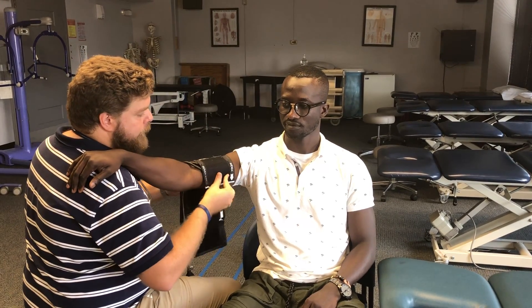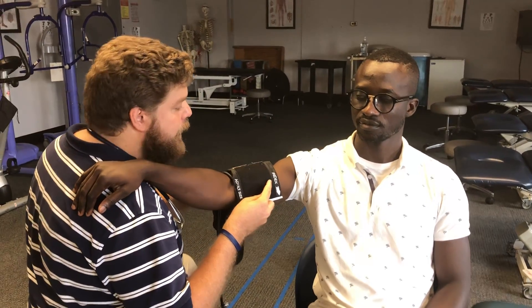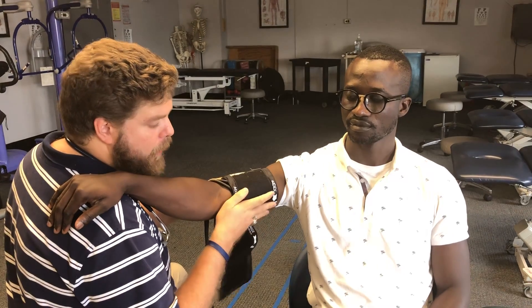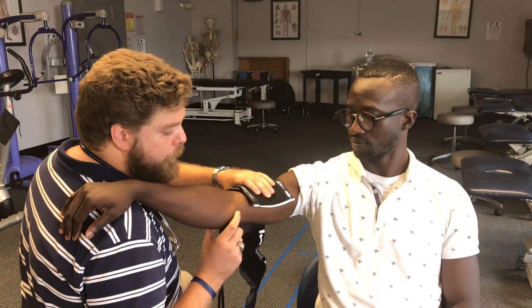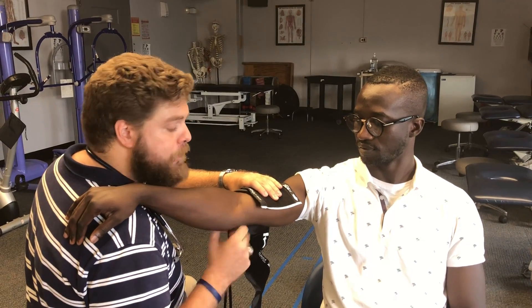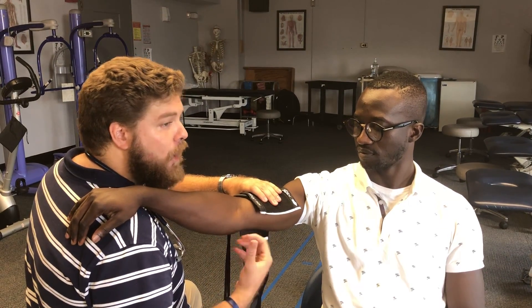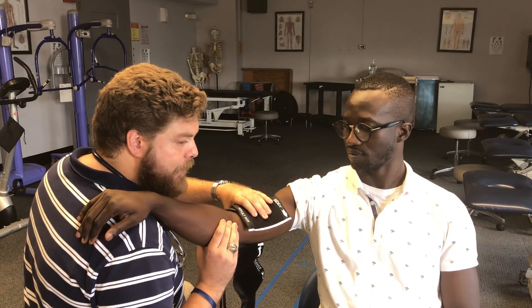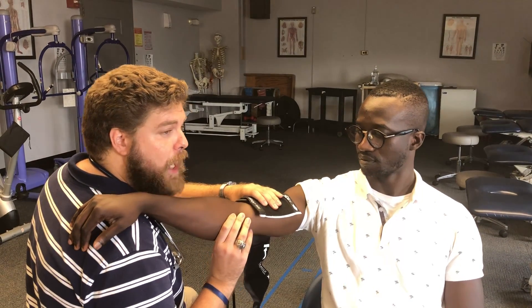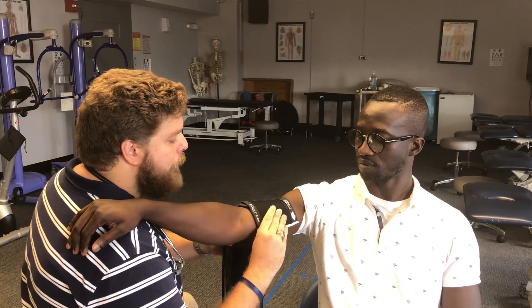Now it's critical that when we place the blood pressure cuff, we don't want to place it too close to the antecubital fossa. It should fit right in the meatier part of the biceps, so you have enough space to access where the brachial artery will emerge, which is right here. It's also critical that his elbow stays as straight as possible. What we're basically doing with the blood pressure cuff is amplifying the sound of the occluded artery returning flow. If his elbow's bent, it's not going to bring the arteries close to the surface. We want to keep it as straight as possible so when we place our scope, we can hear the sound as clearly as possible.